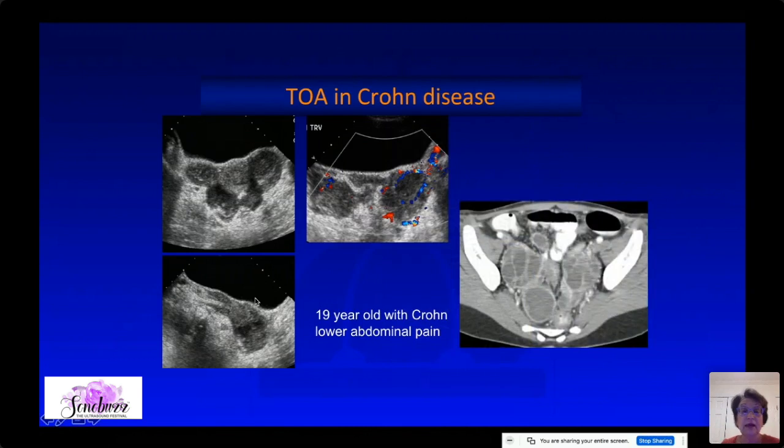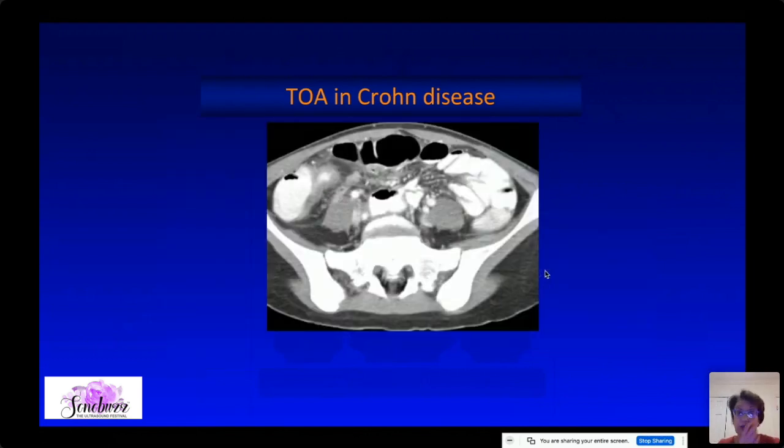This is a patient with Crohn's disease who has bilateral tubo-ovarian abscesses. But in addition to that, she has this kind of fistulous tract. Again, echogenic fat, hypervascular lesion. And you can see the complex bilateral pelvic abscesses with fistulous tract in patients with Crohn's disease. And sometimes these patients will present first on ultrasound as their first manifestation of Crohn's disease. So you have to think about the diagnosis. Again, here's a thickened terminal ileum in that patient.